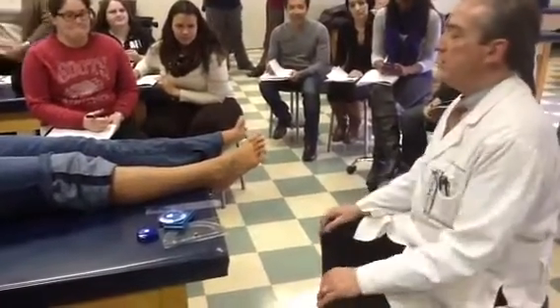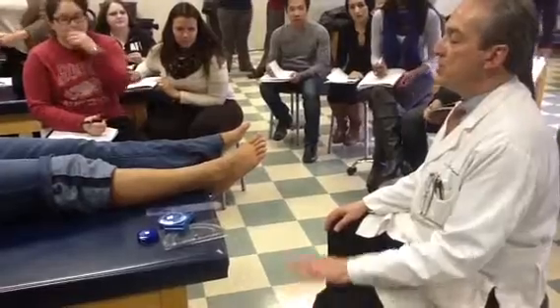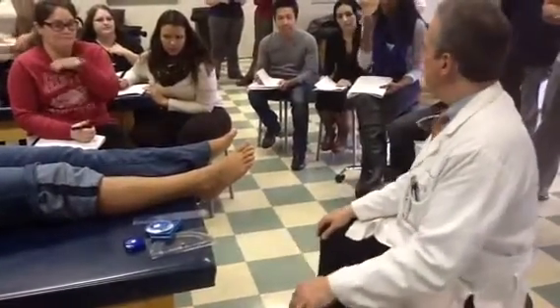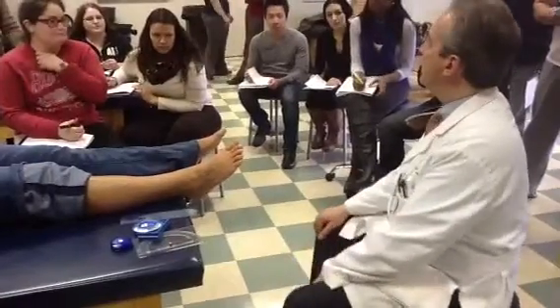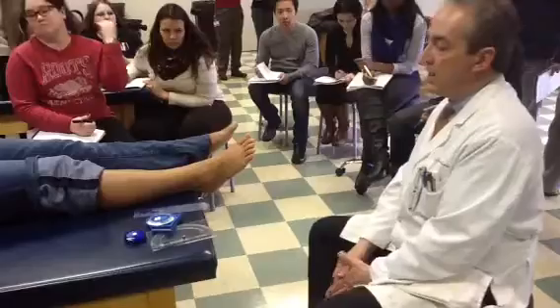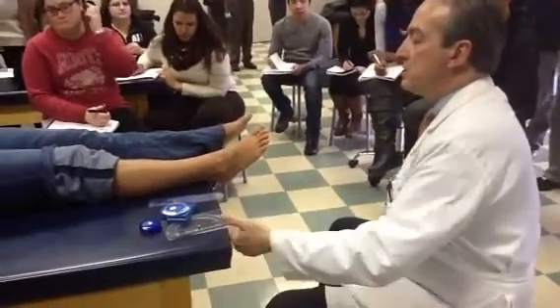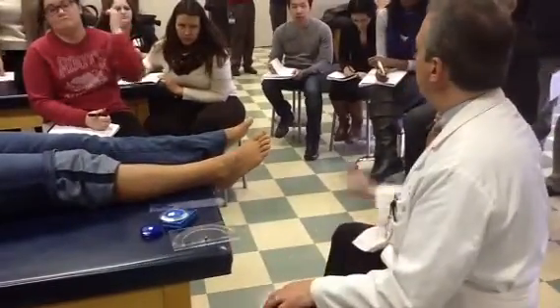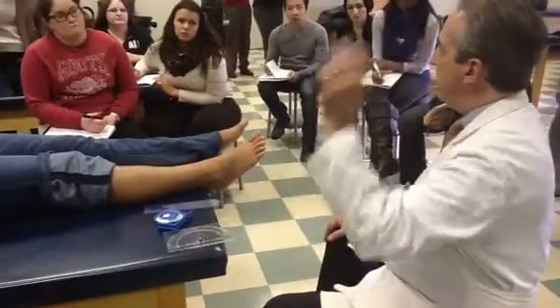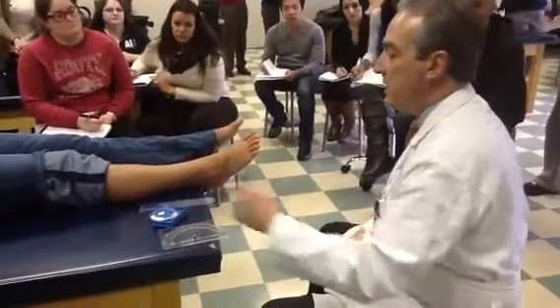And the way I'm going to group it is into measurements that you can do with the patient on an exam table as opposed to the stance measurements. Alright, it's a little easier to group it that way, and I think it's a little easier to follow some of the logic in what we're doing. Basically, you can use 3 different tools to obtain the measurements we need, and 1 tool for limb length discrepancy. So you need a tape measure to measure limb length discrepancy.